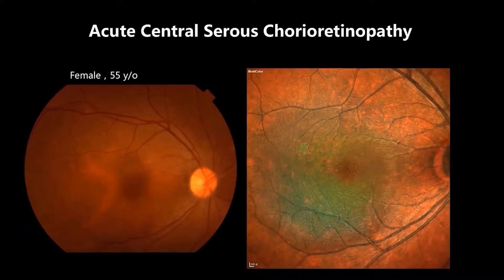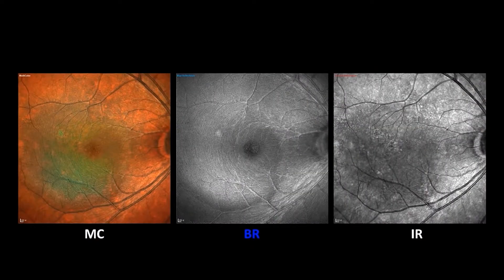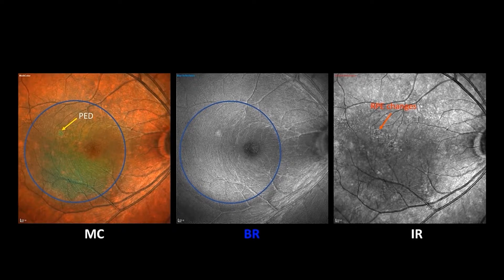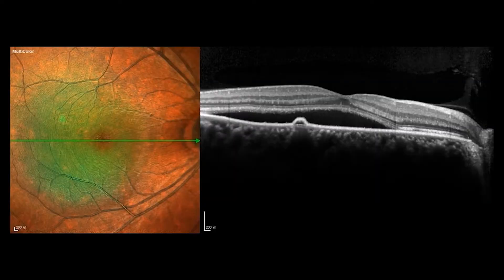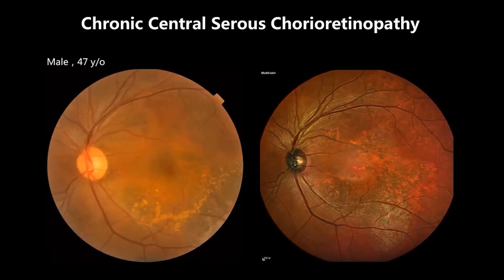This is a patient with acute central serous chorioretinopathy. Multicolor image demonstrates a green area which corresponds to the area of subretinal fluid. Color fundus photo does not show subretinal fluid well. PED showed up on multicolor as well as blue reflectance. Infrared reflectance reveals RPE changes. OCT shows subretinal fluid and PED.